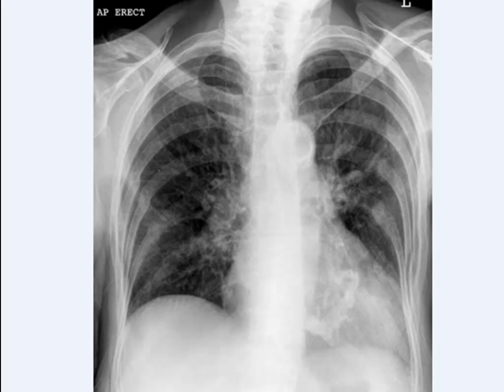What could be the reason for such orientation of anterior ribs? Well, this is the typical picture if a patient has kyphosis, which means hunchback or bowing of the spine in simple English.